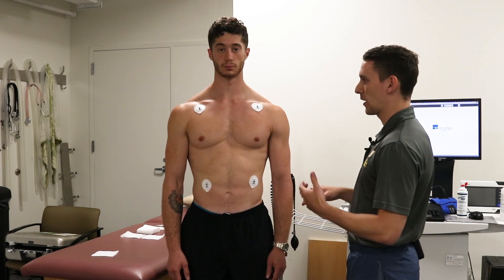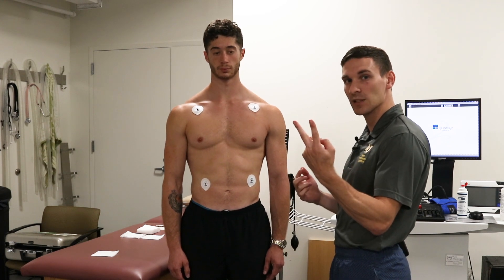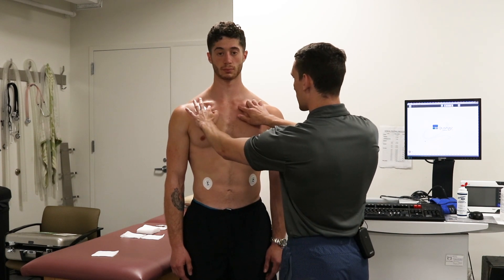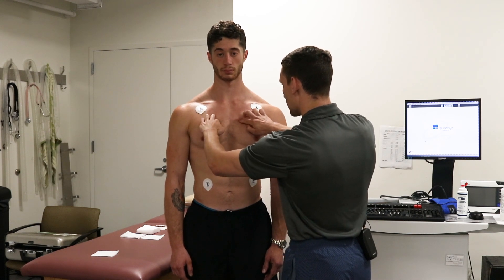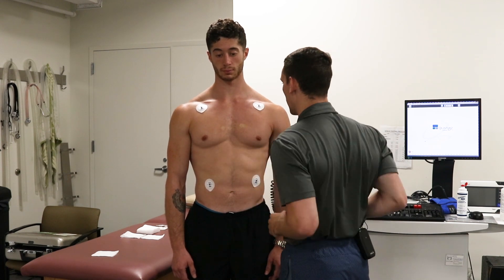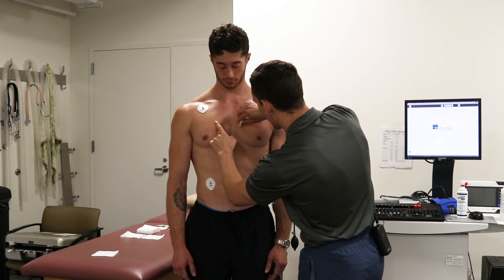Now from here we're going to go into our V leads. The first lead, V1, is going to be on the right side of the body. We're going to find V1 and V2 at the same time — those are going to be in the fourth intercostal space in the mid chest. We palpate by finding the clavicle: right underneath the clavicle we find one, then the next intercostal space — that's two — then the third, and finally down to the fourth intercostal space. You want to find where the sternum is and go just outside of the sternum, avoiding placing an electrode over the bone. After finding those spots, we take our alcohol and wipe.